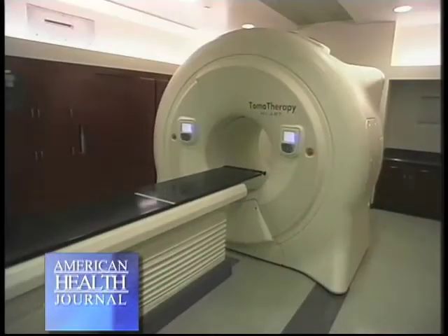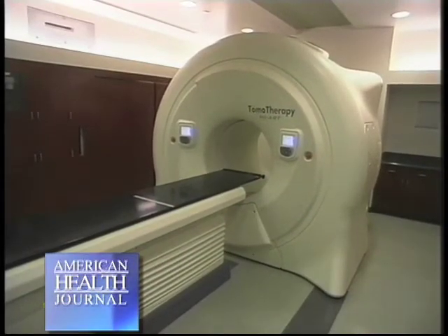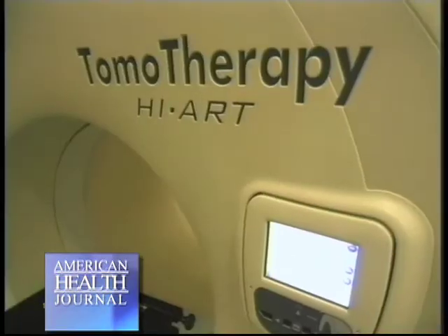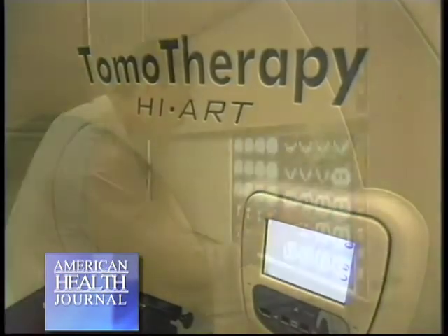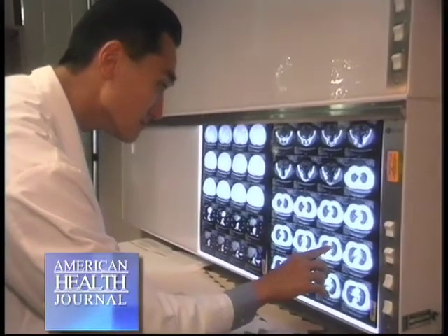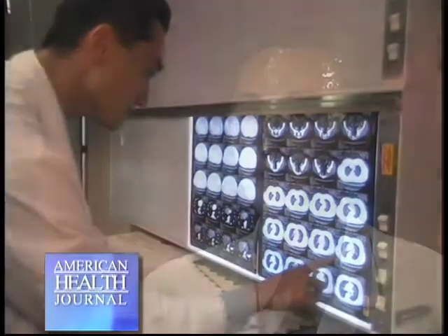And so what the tomotherapy machine allows you to do is to get a CAT scan every day before your treatment to know exactly where your tumor is, exactly where the normal organs that you're trying to avoid with radiation are, and it allows you to accurately target the tumor. The benefit is that you know you're not missing the tumor, but also it allows us to what I call dose sculpting, meaning we can put the dose of radiation now where we want it to go and avoid the things that we want to avoid, where typically before we weren't able to do that with the technology that we had previously.